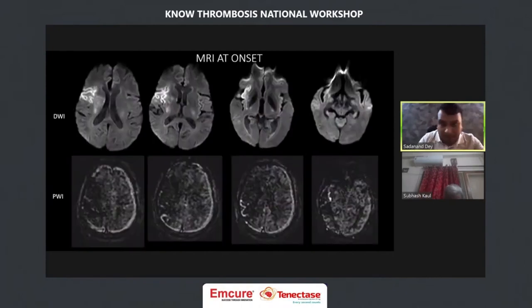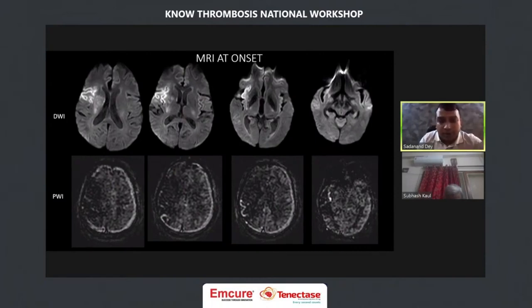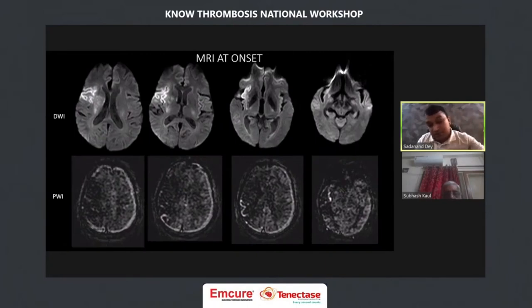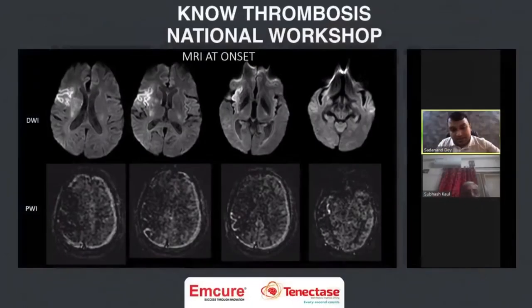This was the MRI at onset. Similar to the CT, you can see the perisylvian area, M2 and M4 already involved, with early diffusion restriction in the basal ganglia region. On the perfusion-weighted images, you can see a large perfusion deficit. So while diffusion restriction already matches the CT scan findings, there is still a large perfusion area representing salvageable penumbra.